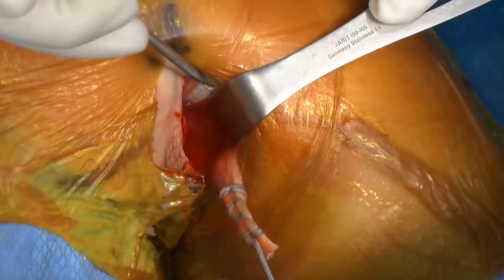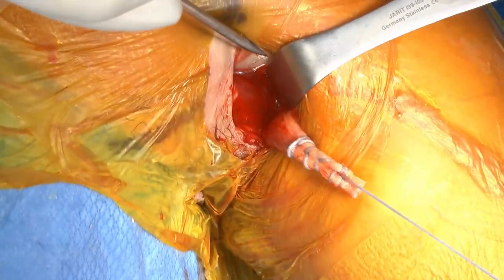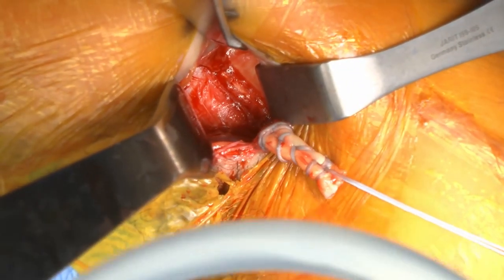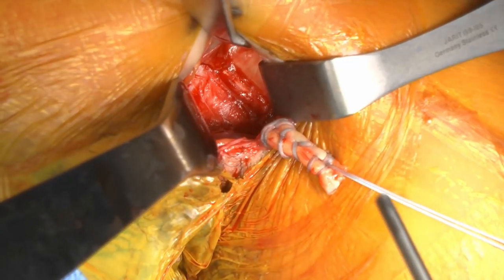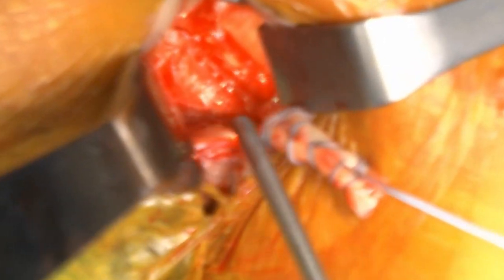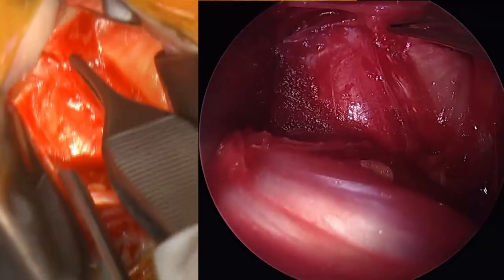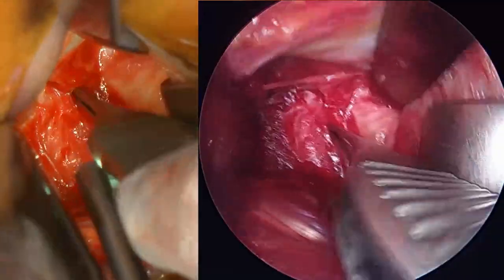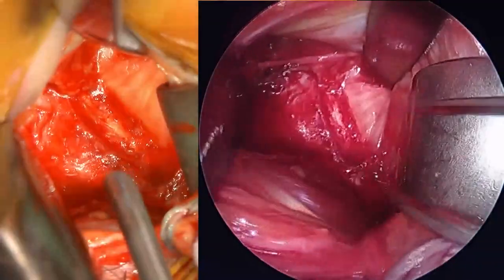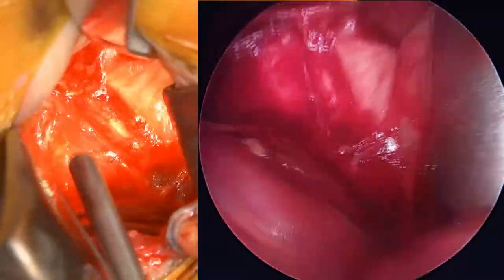All right, so now we're ready to fix our biceps tendon in the right position. So now we're going to get reset. Here's again our landmarks. If we look right in here, there's our biceps tendon. As we come over the top and into the space that we're operating on, let me have something to mark with. We have the pec tendon here on this side. This is our bicipital groove, and that's our latissimus tendon right here. We have a smooth retractor on both sides, so we'd like to put our biceps right in this hole here.